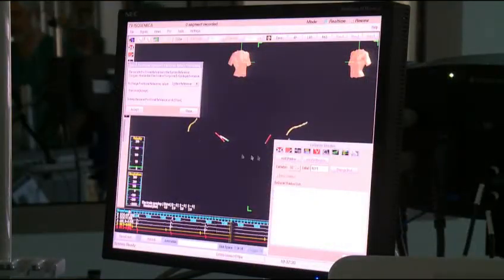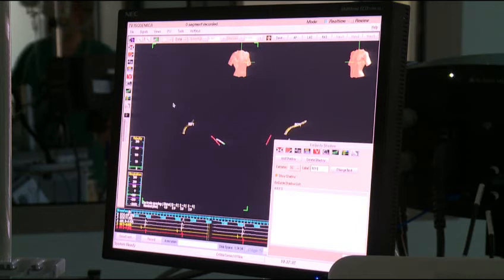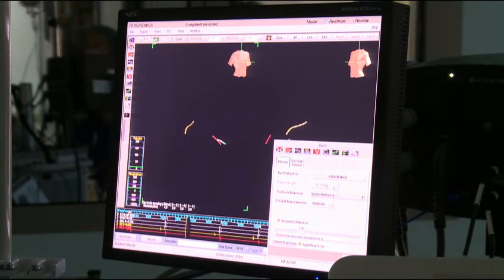Ahora lo que vemos en la pantalla son los tres catéteres que están introducidos en el corazón, dos en el lado derecho y uno en el lado izquierdo. Ahora lo que vamos a hacer es la reconstrucción anatómica de la cavidad, en este caso del ventrículo izquierdo.